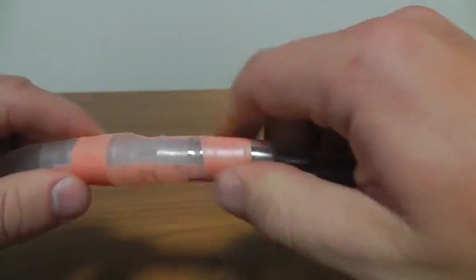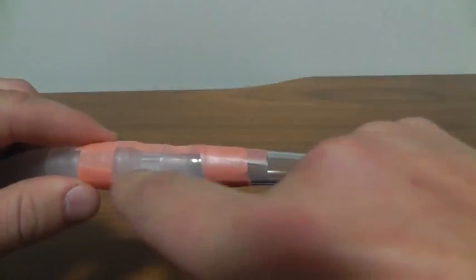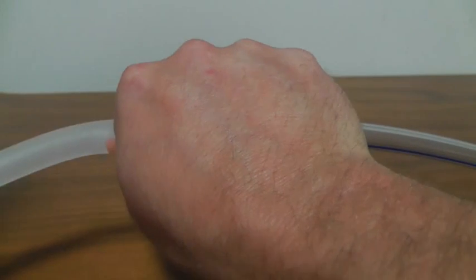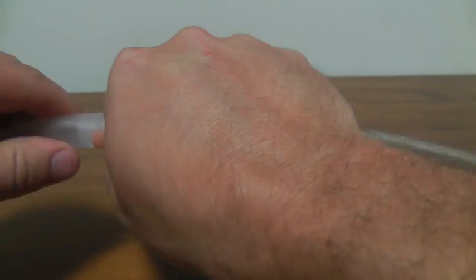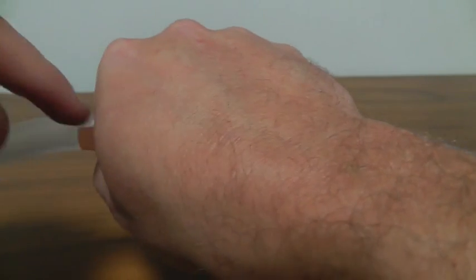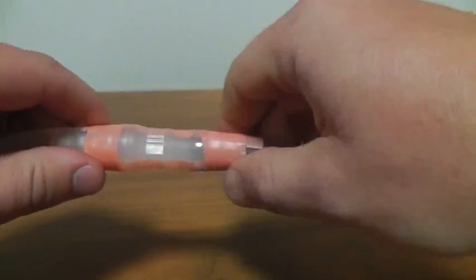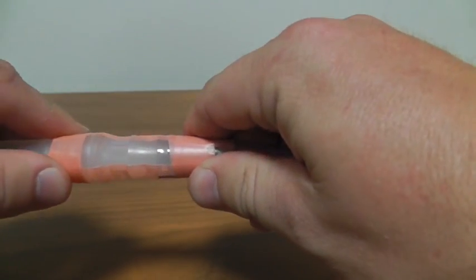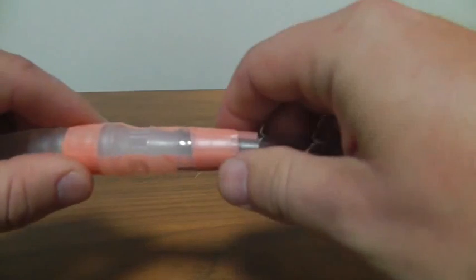What this does is it creates a visible connection. What you don't want to do is wrap this whole thing up with Sleek, because if the tube disconnects but it's still held on by a bit of tape, you're going to start entraining air and you can cause a recurrence of a tension pneumothorax in a patient with a chest drain in and that's not what you want.